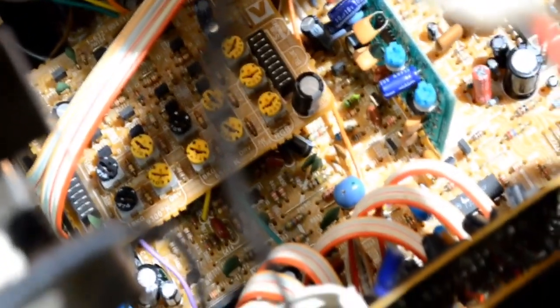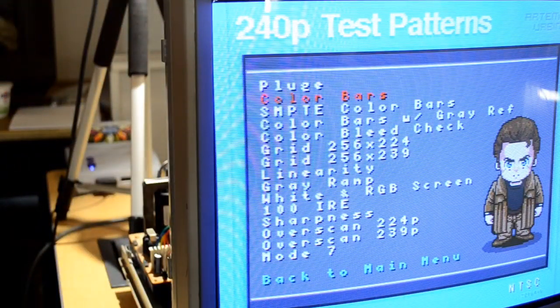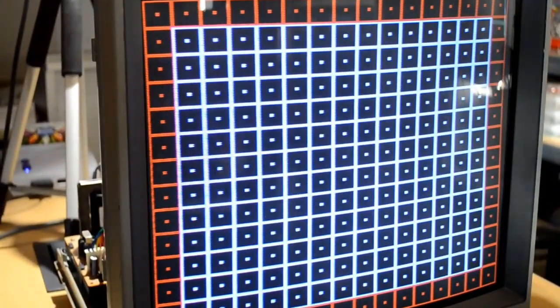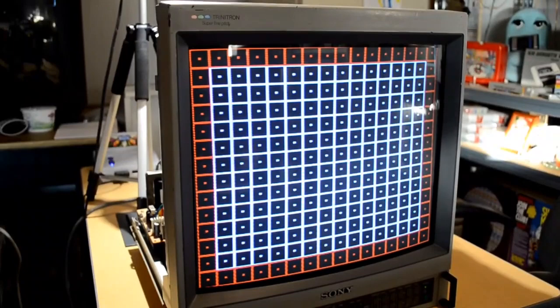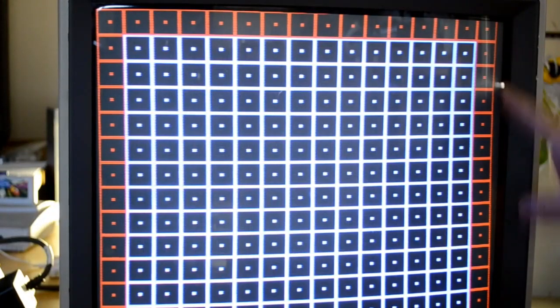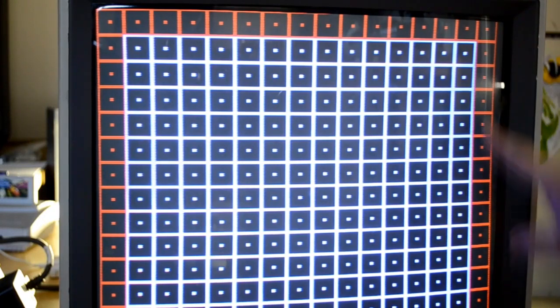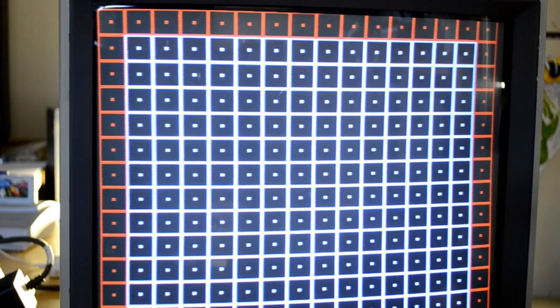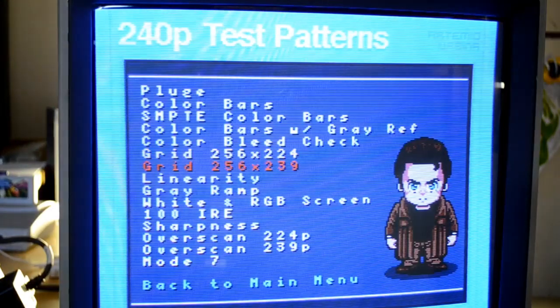There is a daughter board again in here too. That's a V board that does have some adjustments where if you need to make like a quick color or screen brightness adjustment, you can do that by using those adjustments. But the main thing in here was to just get in there and start using those potentiometers. So again, I will tag that right here above if you want to see exactly how to get in and calibrate a monitor like this, because even after recapping it, there's always going to be some kind of need to make a little bit of an adjustment most of the time.